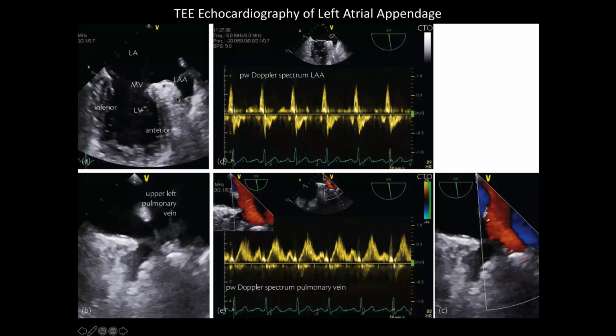And so particularly in atrial fibrillation, if this is not contracting the way you saw in that CT, it's just sitting there and it's a conduit. It's kind of a very distal conduit, right? It's a long way away from just where the blood is swirling around in the left atrium. And so that can lead to this coagulation and making a thrombus. And for those people who are in atrial fibrillation, people believe that 80% of the strokes suffered by those patients are caused by thrombus that occurs in this thing, right? And so it's a really important feature that you can image quite well with TEE.